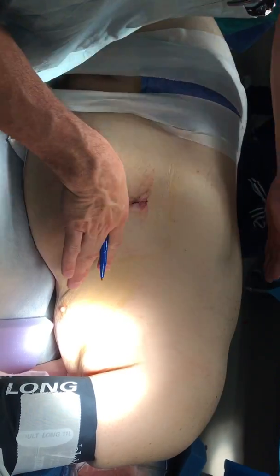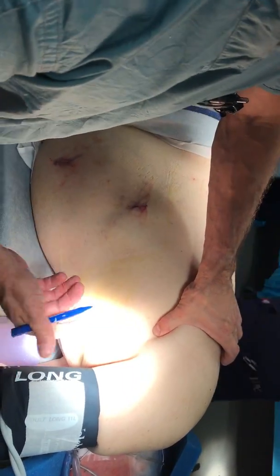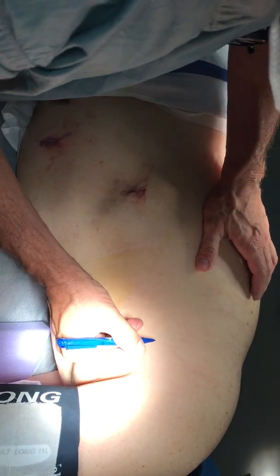We're going to rotate the patient even more anteriorly after we put these ports in. We don't want to be working over our head. So here's the scapula right here. That's a mistake because when you go to move your hand, you hit down here, so you want to be right here.